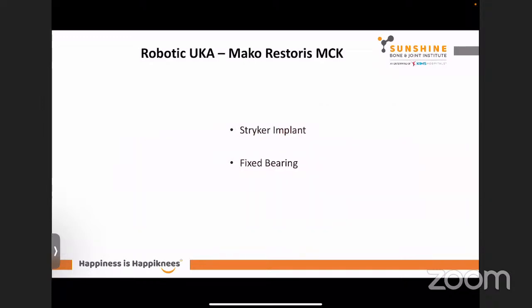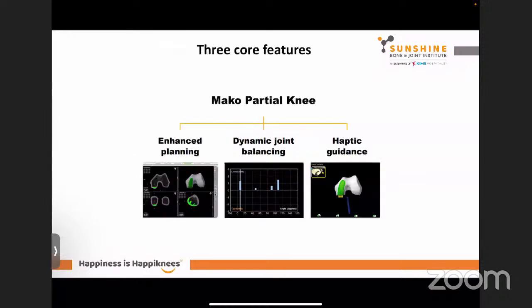So now you can use the Mako Restoris MCK, okay? It's a Stryker implant and it's a fixed bearing. So differences between this and the Oxford. All the robotic companies are now coming with unis as well. It's not just the Stryker, but I'm speaking specifically about this.